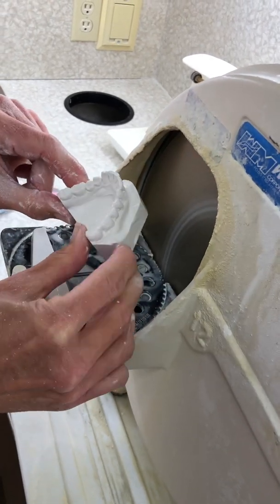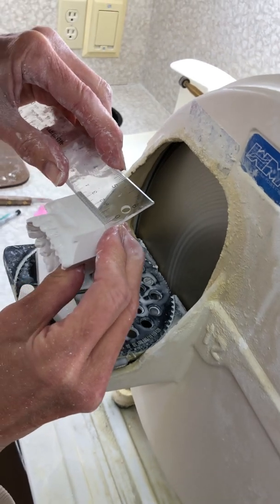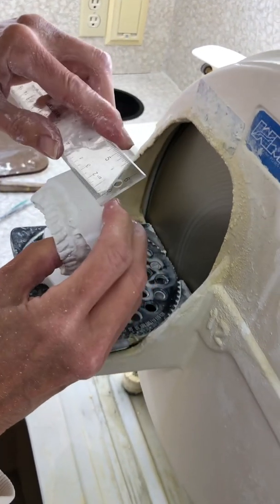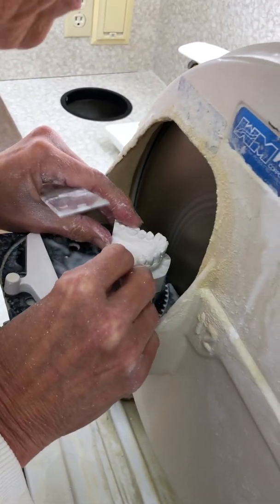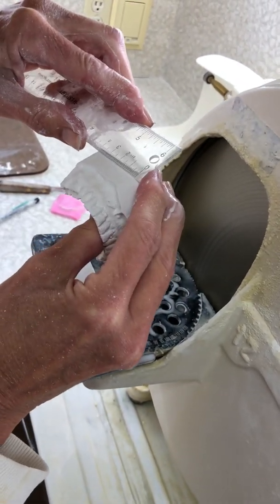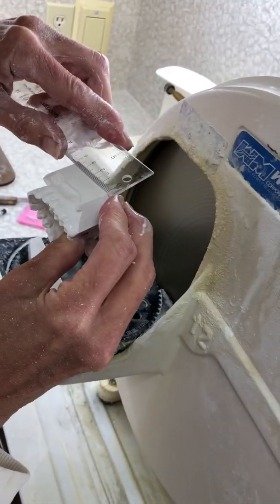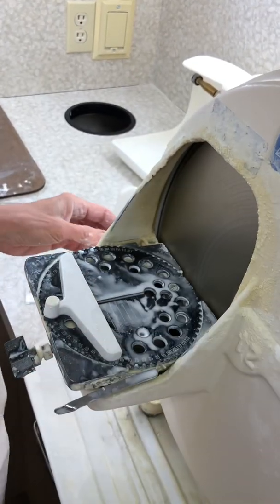And again, you want to make sure you're symmetric. So let's measure this. So we're at 39 and a half. On this side, we are at 40. So let me just take a little bit more off of here. Yeah. So there we are. Bottom's all done. All right, so let's give it a rinse.